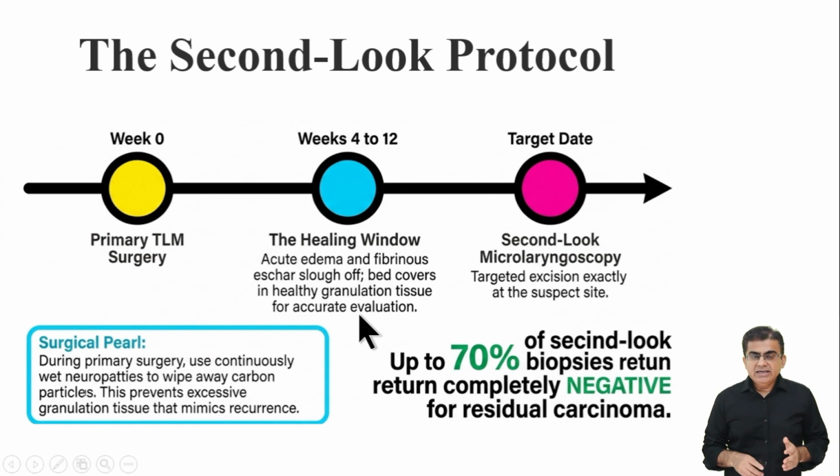So on your target date, you bring the patient back to the operating room. You perform a targeted microlaryngoscopy and safely cut out a very narrow strip of tissue exactly at the suspect site.